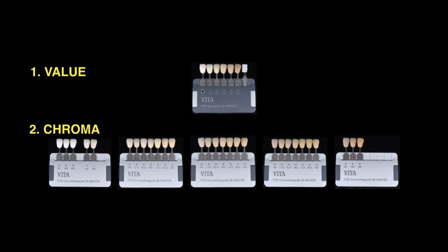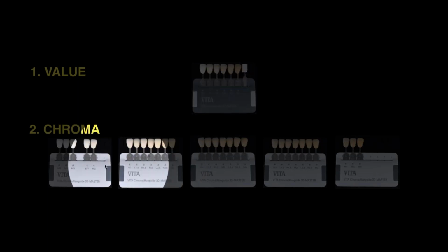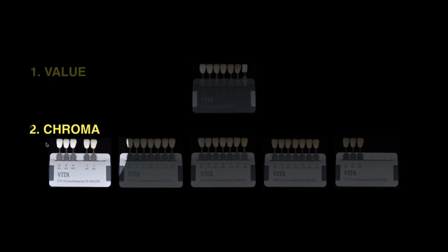If I picked 1M2 as my base, well, then all I need to do is go to my 1M2 guide. And in the 1M2 guide, you'll notice that their bleaching guides are here, but they also have 1M1 and 1M2. What would I be looking for? Is the coloration now brighter than the 1M2, or is there more chroma? Bright is a bad word, I shouldn't use that. Is there more chroma than in the 1M2, or is there less chroma?